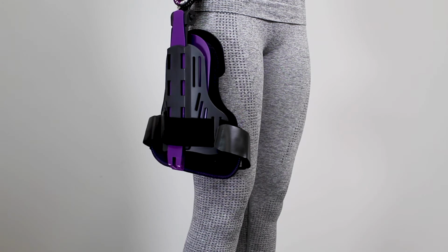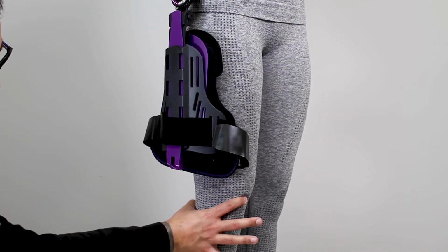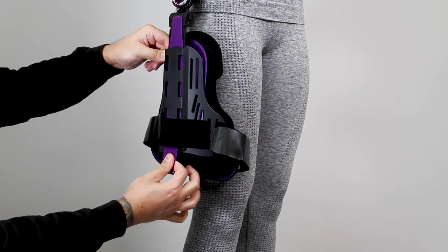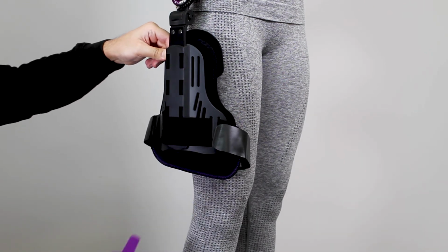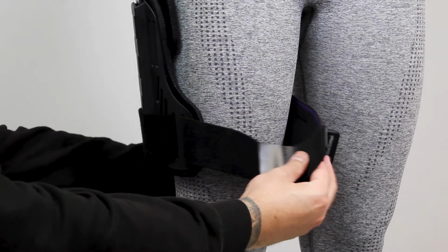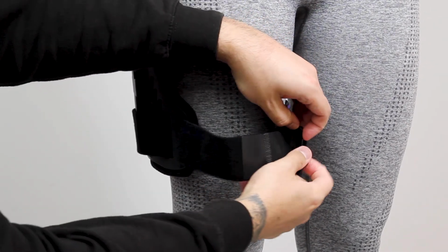Slide the thigh component to the desired position, leaving enough clearance for knee flexion. Remove protective strip once the desired length has been achieved. Wrap the thigh strap around and feed through the 2 D-rings for equal compression.